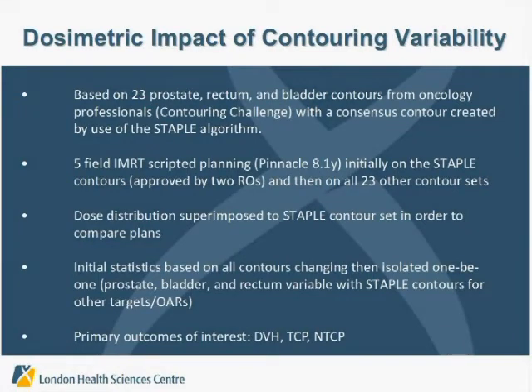One last piece of information I just wanted to tease everybody's appetite with is looking at the dosimetric impact of contouring variability. There is not a lot of data with regards to this in the literature. There is some, and Ben Nelms has actually done some of that and has published that, I think, in poster form, and maybe that hopefully will be coming out in manuscript form soon.